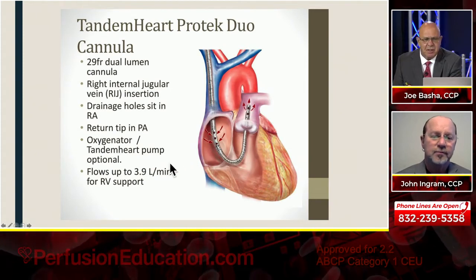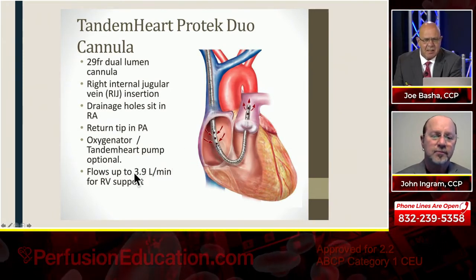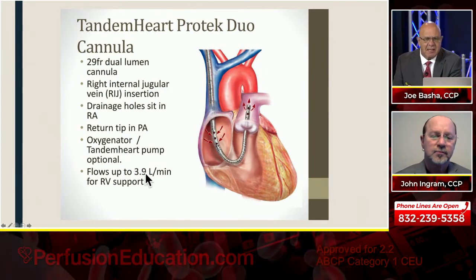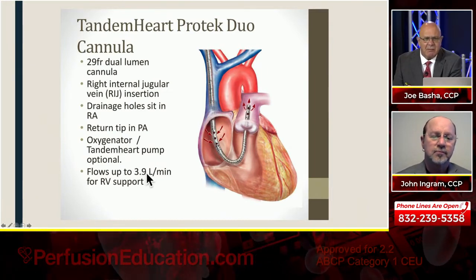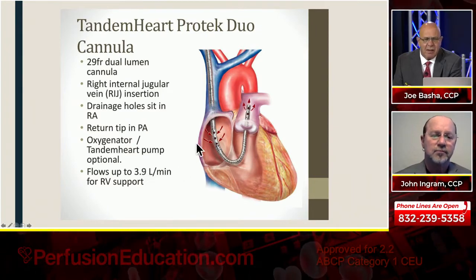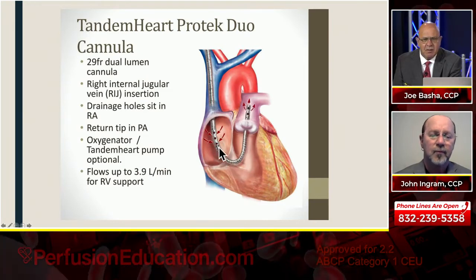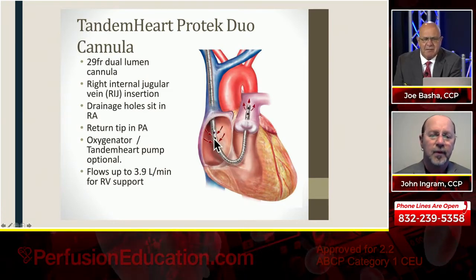But you do have some sacrifice: the flows are 3.9 liters max, and that's hard to achieve without very, very high RPMs. I think it's very good for some right ventricular support. I don't really think it's a good first line for VV ECMO.